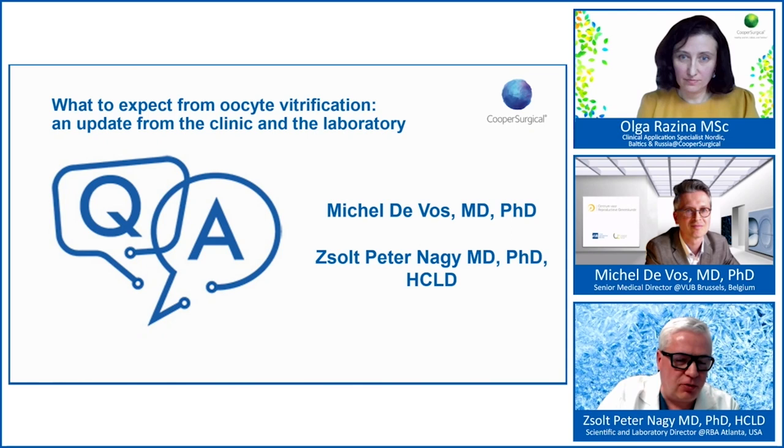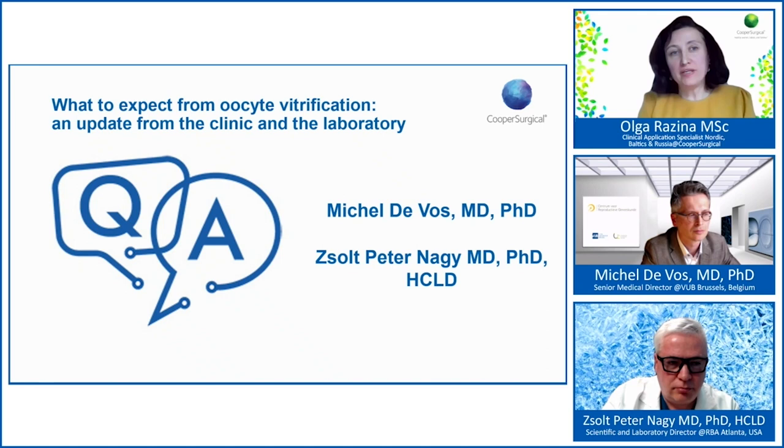Okay, one more question regarding the denudation procedure, because for ICSI, for example, many publications and many authors don't recommend to denude totally, to remove all cumulus cells. Then we talk about oocyte vitrification. How important is it to remove all cumulus cells?